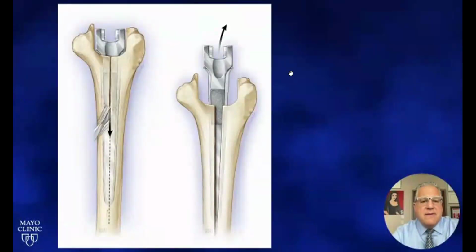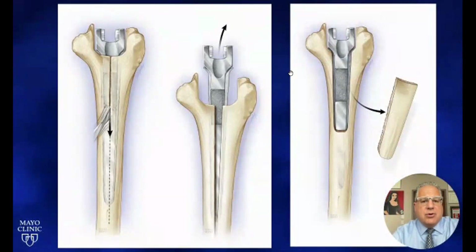On the humeral side, when the implants are well fixed, sometimes it is possible to remove them using a vertical corticotomy, but occasionally it is necessary to create a posterior window that can then be replaced at the end of the procedure.